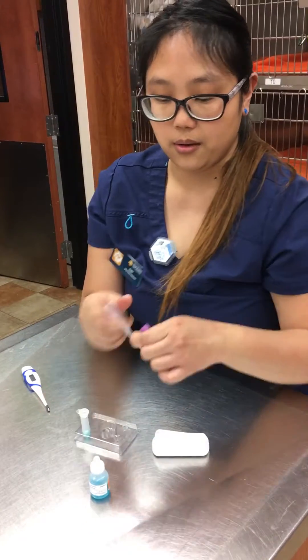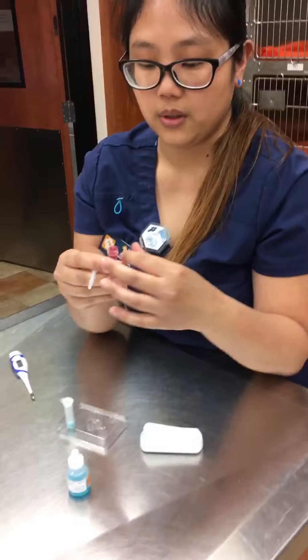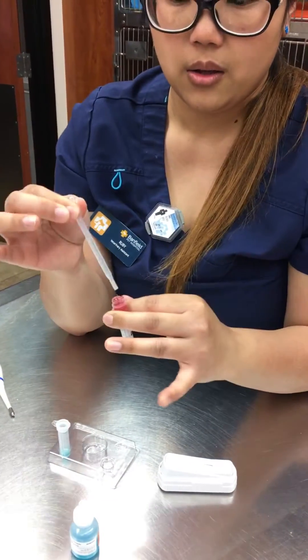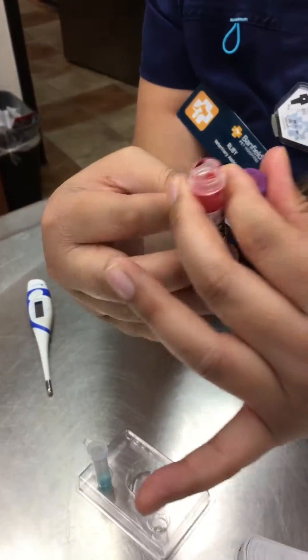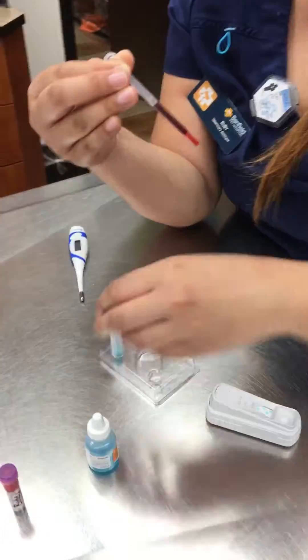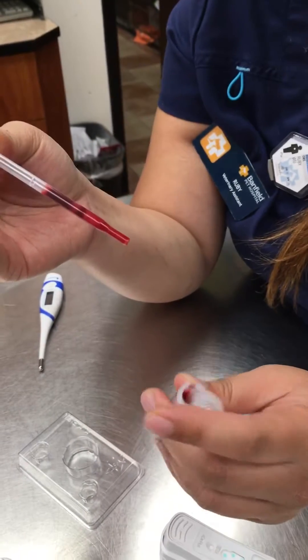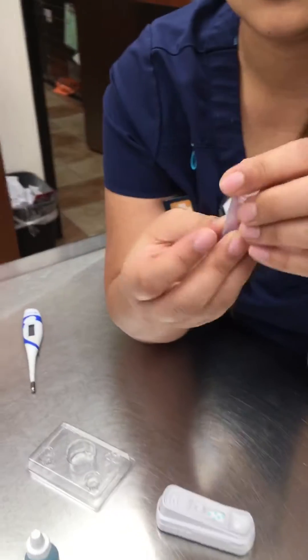I would unscrew the cap and hold it with my other finger so it doesn't drop and the cap doesn't get contaminated. Use a little pipette to take some blood out, close the cap so it doesn't spill, then add three drops — one, two, three. Throw the pipette away.